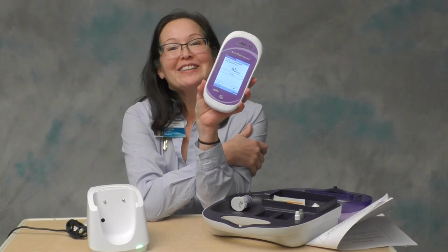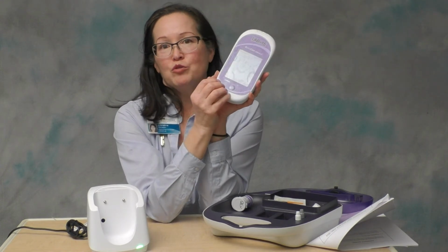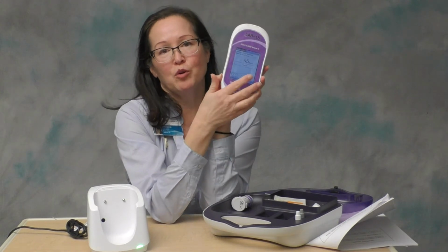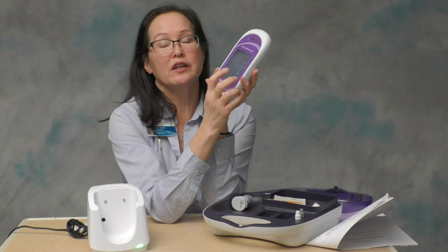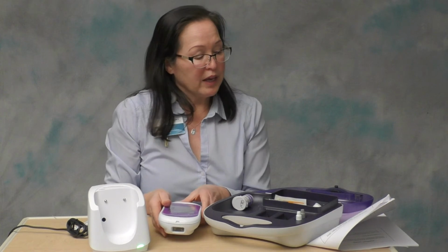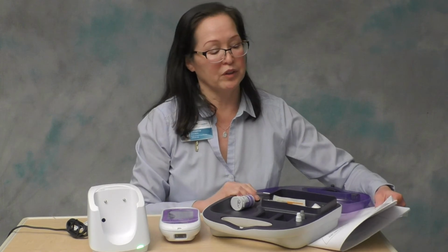On the floors, right. So when you're on the floor, once you've run the QC, it will just say pass or fail. When you're running your direct observation with us, it's actually going to give you a numeric value, and we're going to ask you to record that on your checklist. So when your QC has passed, you can hit the green check mark, and then you'll have to do the second QC level. So that's how you run QC. Now when we do our direct observations, we're going to require that you run both levels of the QC. You'll receive a numeric value and you'll record that on your checklist with us.